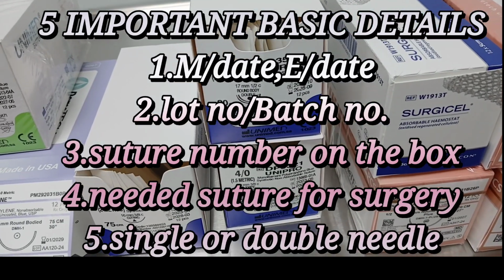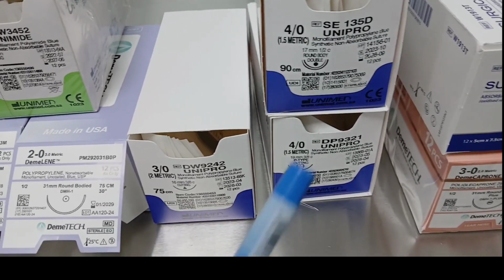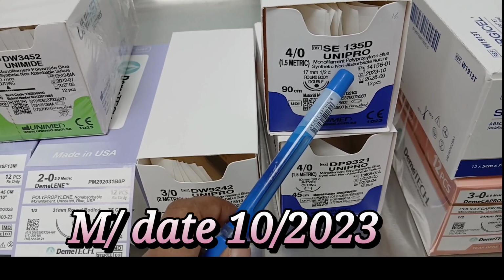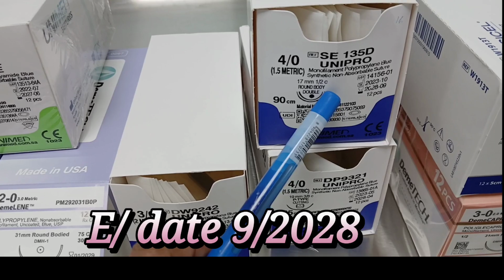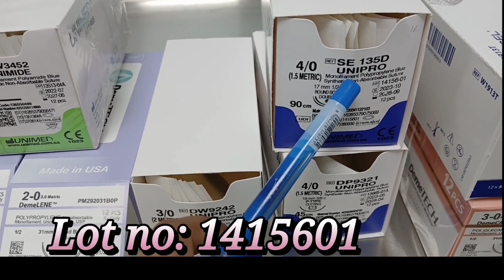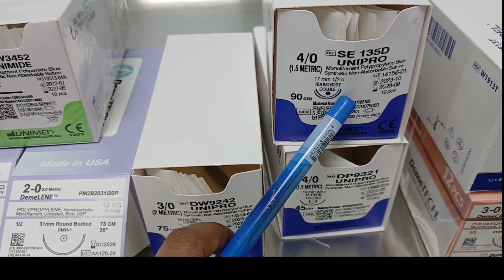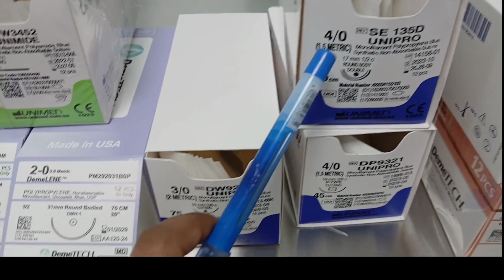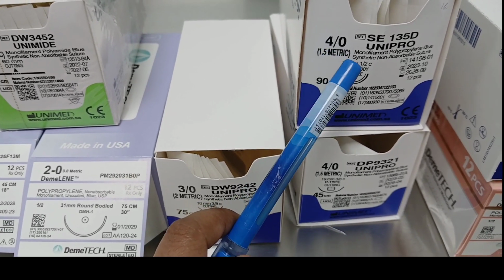Now I will show how to see the manufacture date, expiry date and lot number. This one is the manufacture date 10th month 2023 and expiry is 9th month 2028 and lot number 1415601. So this one we have to see first. Then we have to see the suture number. Here you can see this is the suture number 4-0 suture.